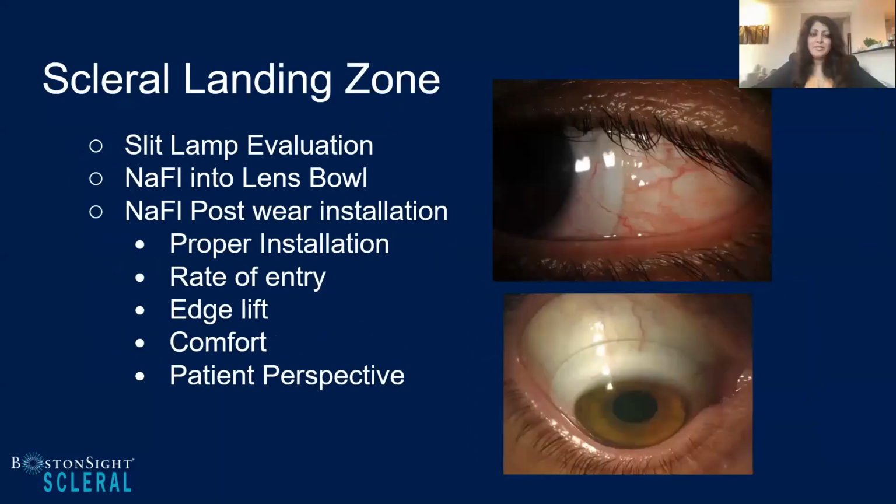Absolutely. So the scleral landing zone, this is the outermost edge of the lens. For me, this is the most important zone of the whole thing. This is what really determines how this lens is going to fit. This determines the comfort of the lens. You can evaluate this initially with the sodium fluorescein in the bowl of the lens, or you can evaluate it after the lens is settled by putting fluorescein on top of the lens. There are many different ways to do this. Some people paint fluorescein onto the surface of the lens. Some will put it at the superior conj and let it drain in.